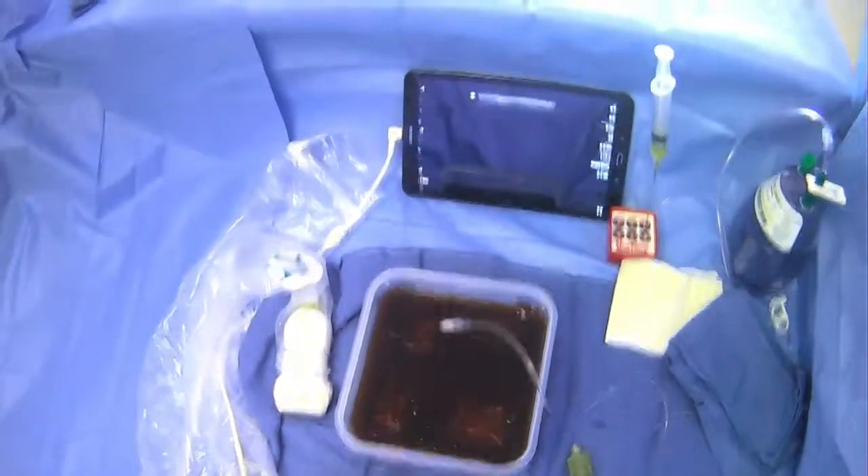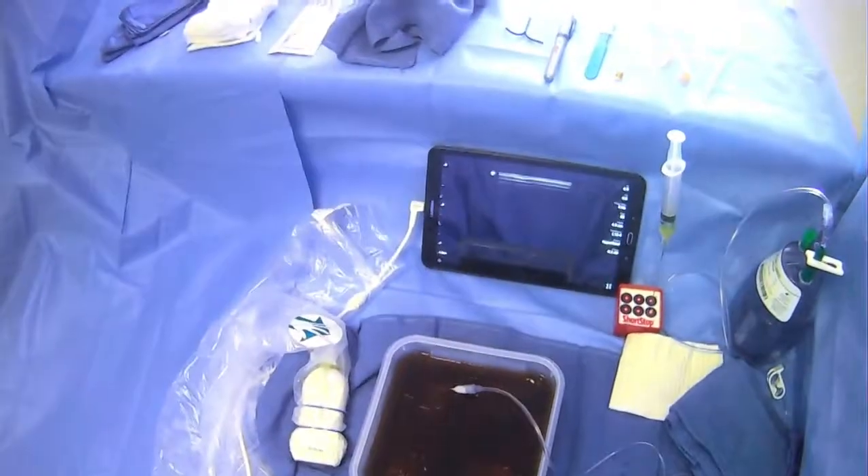Just a quick overview: if you start with the UE needle for giving lidocaine for the deeper tissues, it sets you up to do everything in one shot, like we just showed here.